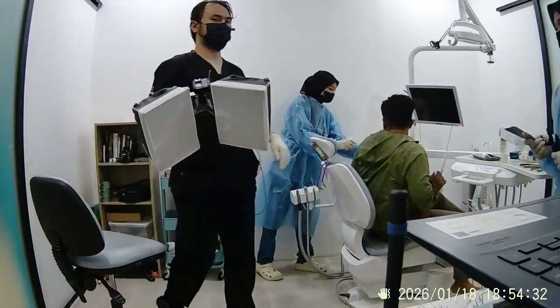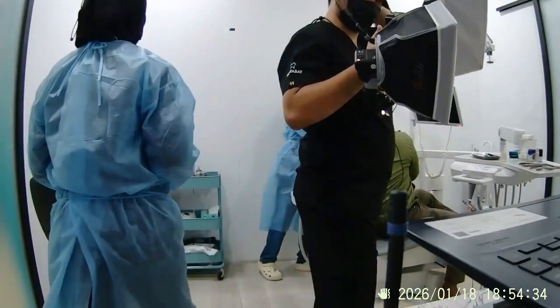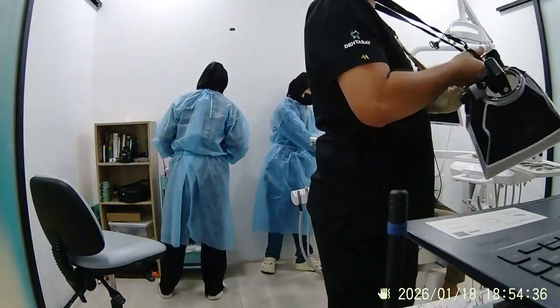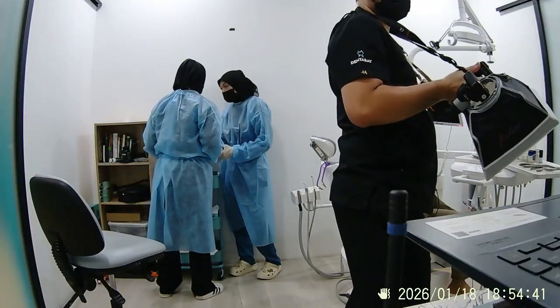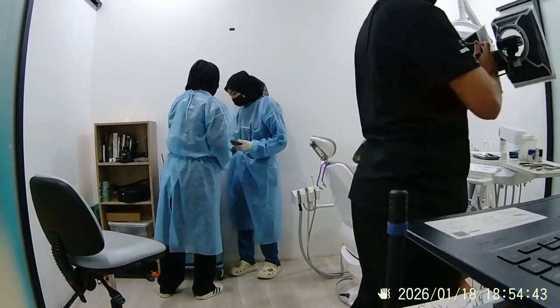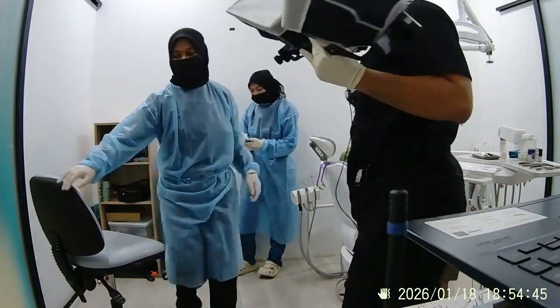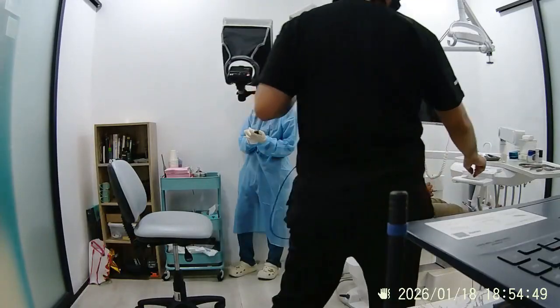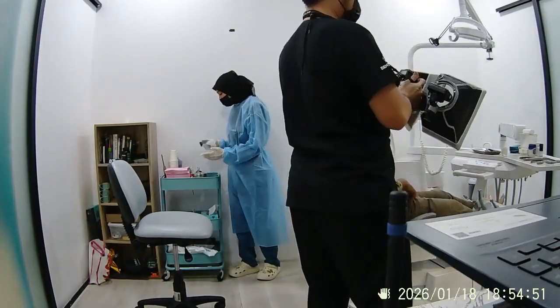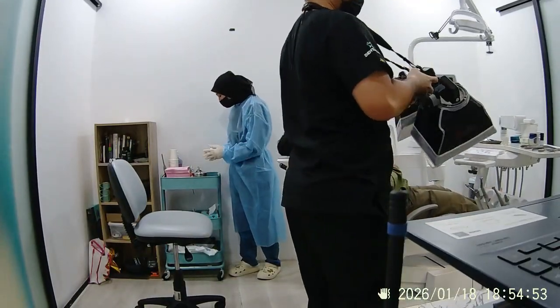So typically, our routine consult will be the initial consult, the rapport building, the problem list, and we take the photos, and later on we send the patient for X-ray. By the time the X-ray is done, the photos have been transferred to the patient's own folder, and we can cross-check and discuss the necessary findings, and basically finalize the treatment planning in the same visit.